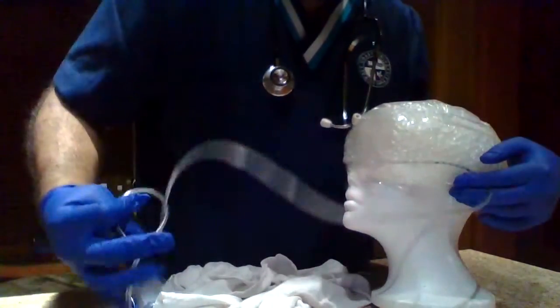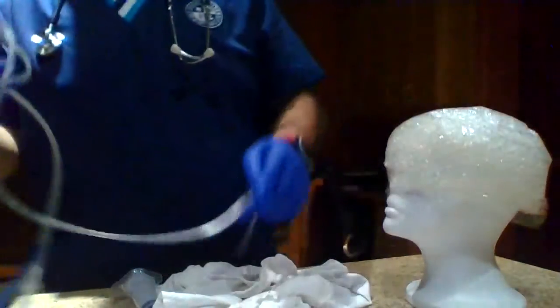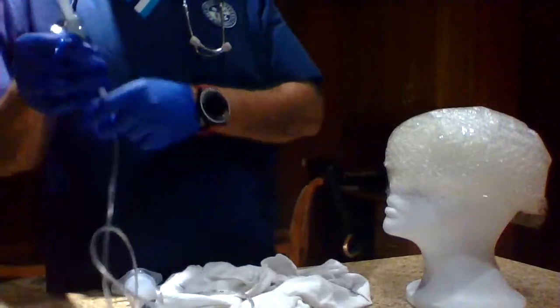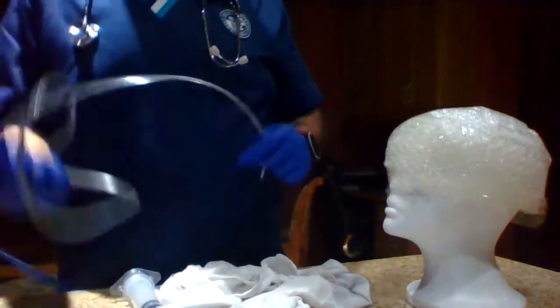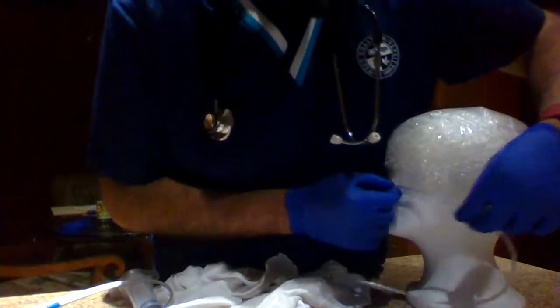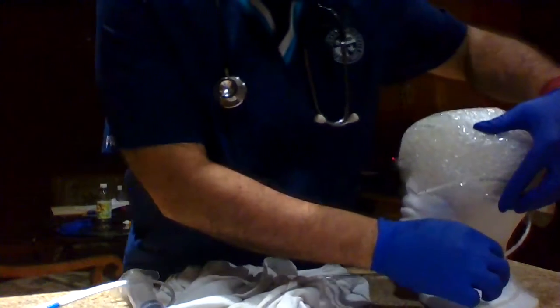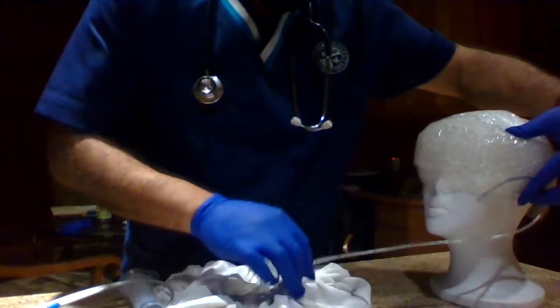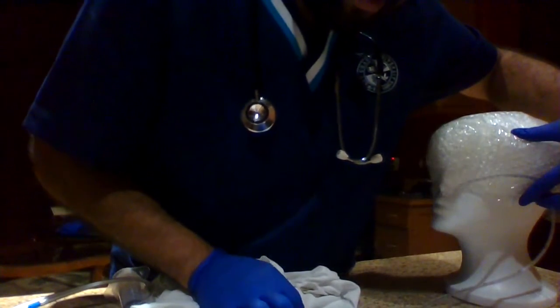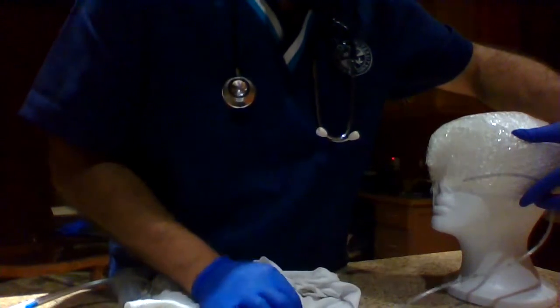So we're going to bring this around, and actually there's a kink there, so let me fix that before we move forward. Okay, now it's proper. So again, we're going to go from the nose to the ear, and we're going to keep it in place. Then we're going to move this to the xiphoid process, which is located in the sternum area. So now we have our placement.